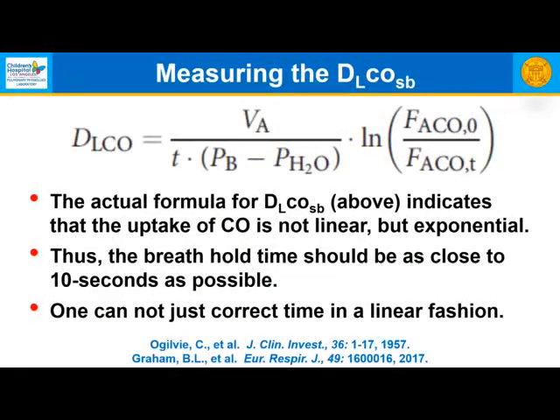The actual formula for the DLCO above indicates that uptake of CO is not linear, but is exponential. It's a natural logarithm here. Thus, the breath hold time should be as close as possible to 10 seconds. One cannot just correct time in a linear fashion and be accurate.